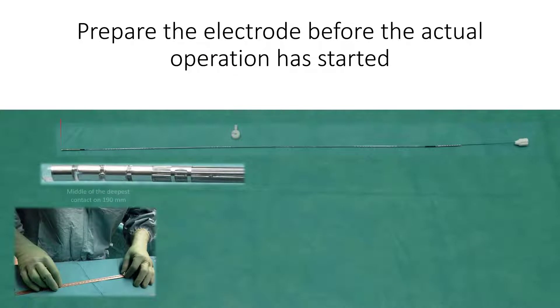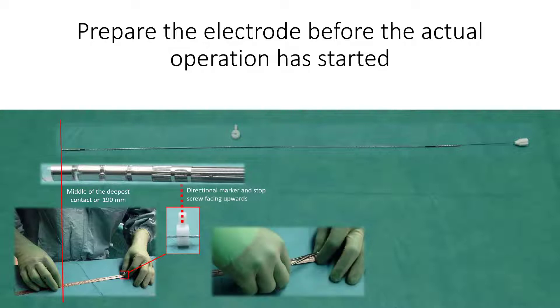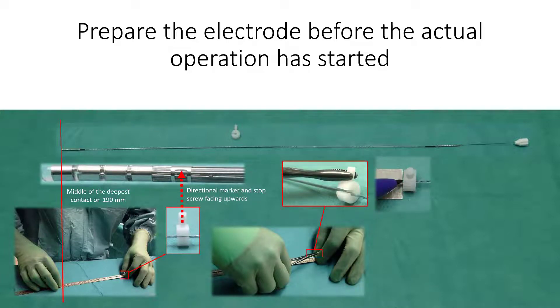Another suggestion is to prepare the electrode before the actual operation has started, perhaps while someone else is doing the dressing, and don't spend time on this during the procedure itself.